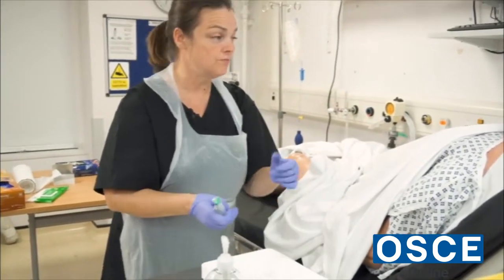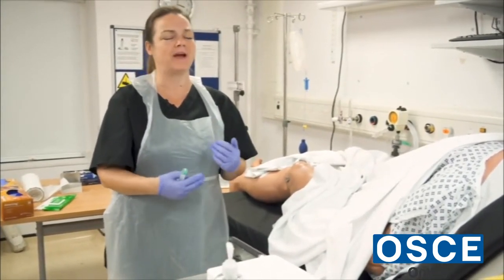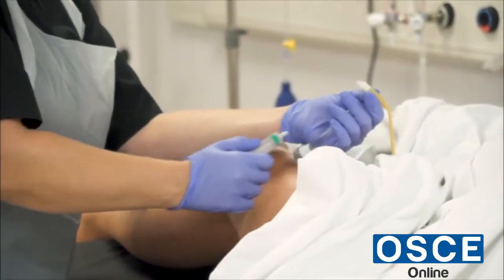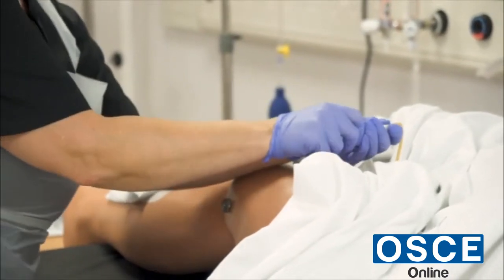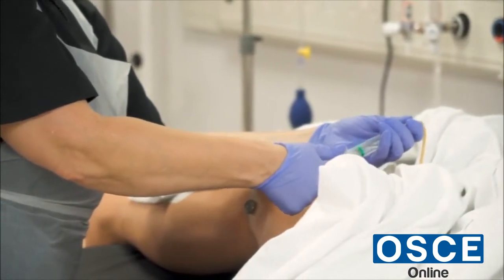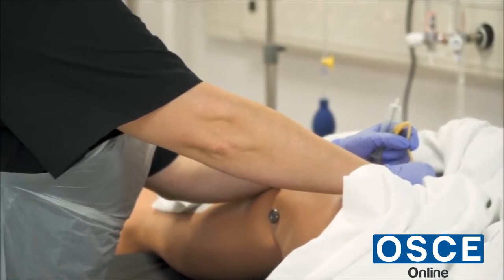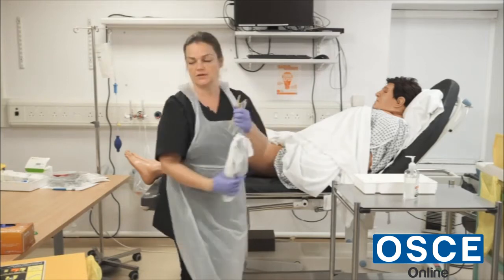When this catheter is removed you may feel a little bit of discomfort as it comes out, so I want you to take a deep breath. It shouldn't be painful — it's more discomfort than anything. I access the balloon port and attach the 10 ml syringe. The catheter has 10 mls of water in it as per the notes. I've taken out the 10 mls of water and very slowly remove the catheter — take a deep breath. The catheter is out; I put it straight into the yellow bin.